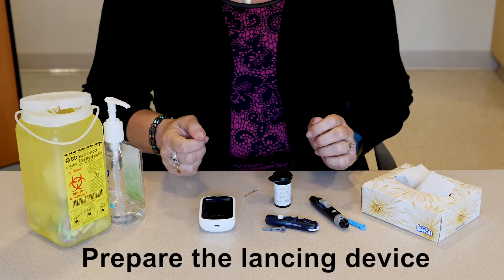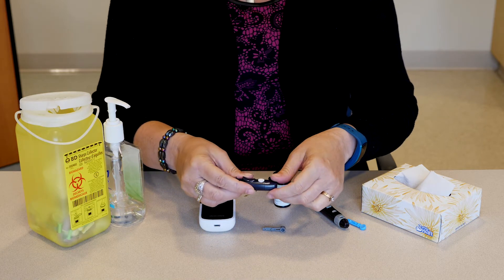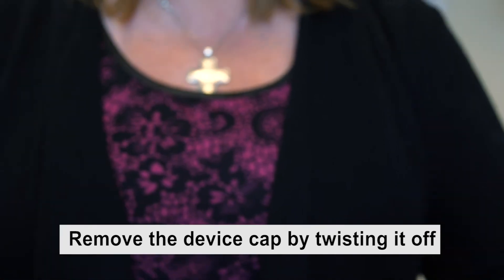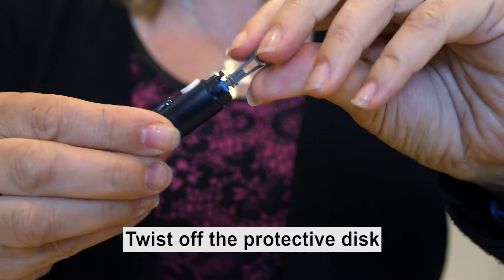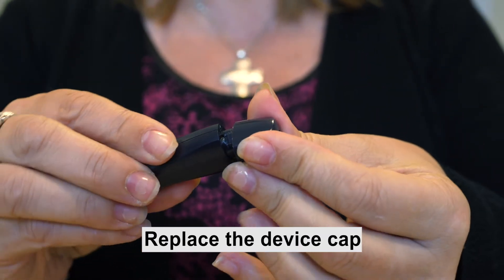Prepare the lancing device. For most lancing devices, you will need to remove the device cap by twisting it off, insert a lancet into the holder, twist off the protective disc, replace the device cap, and adjust the depth setting.